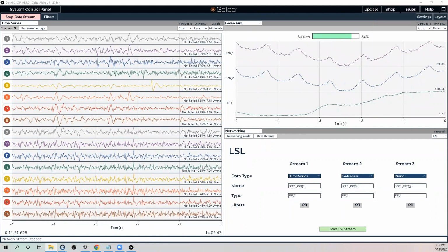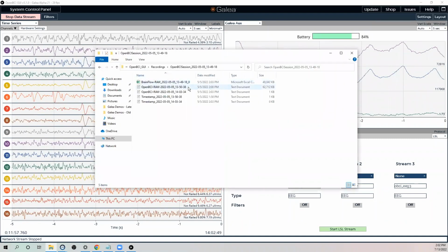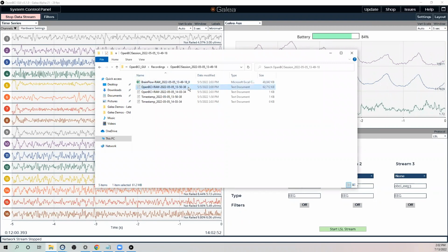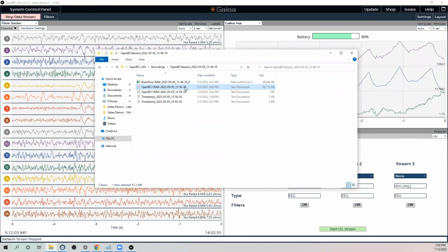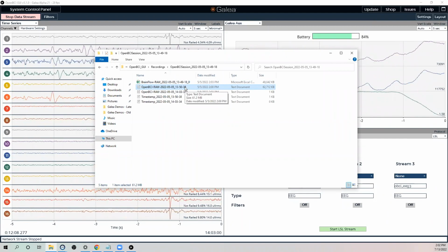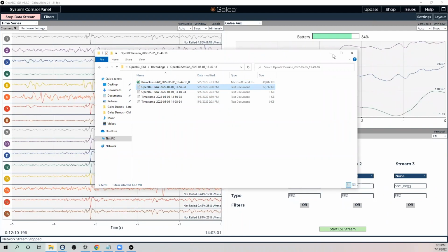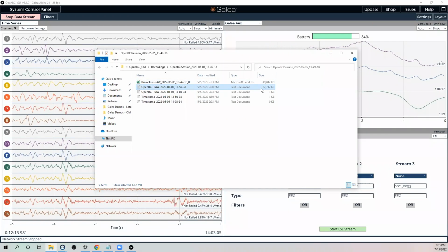Another common question, actually, which we half answered before you guys got dropped last time. How many people have worn a Galea headset? And how consistent is data quality across individuals? What have we done on the mechanical side to account for different head shapes? And maybe Conor, you can talk about what additional improvements we're planning to make between now and beta as well.